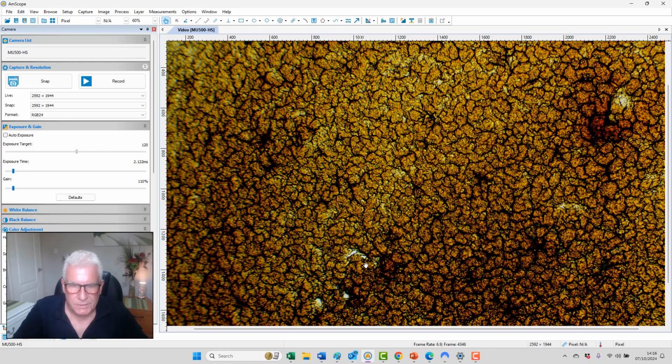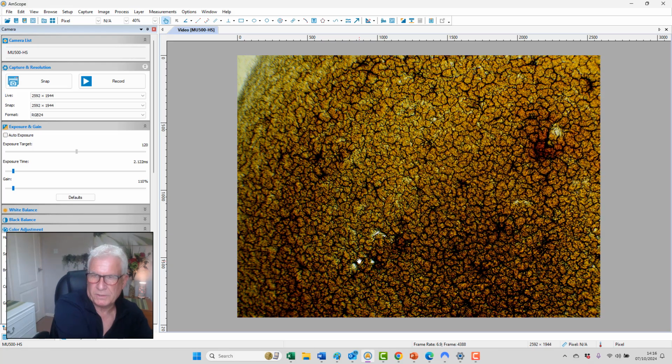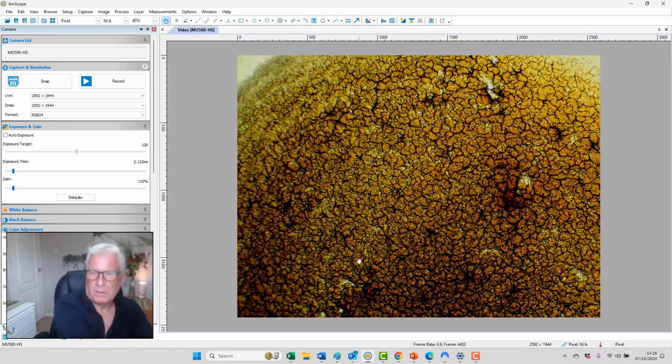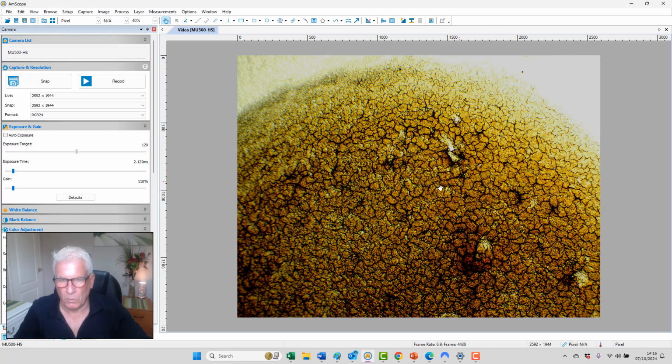these little liver spots. I know some of these things that I'm showing you look the same, but of course I've done over 10,000 of these. I can read this thing like a book. Okay. Poor protein digestion because of the lack of fibrin network, it's not coming through very clear. Oh, there's another cardiovascular marker there.